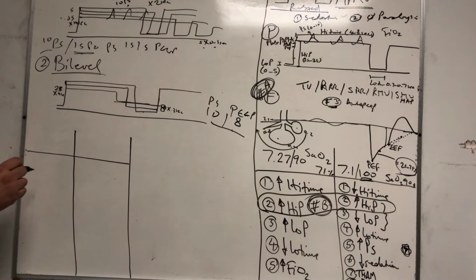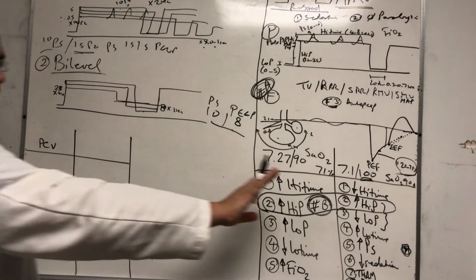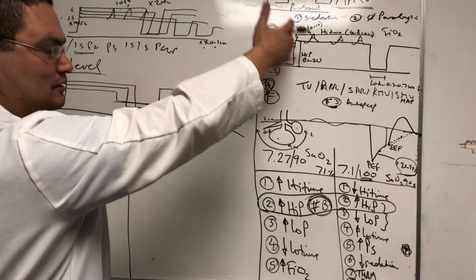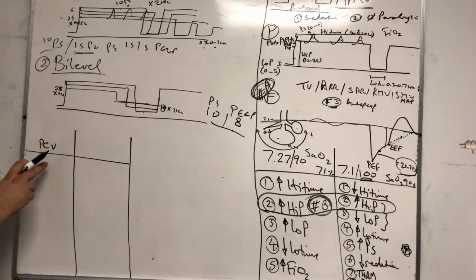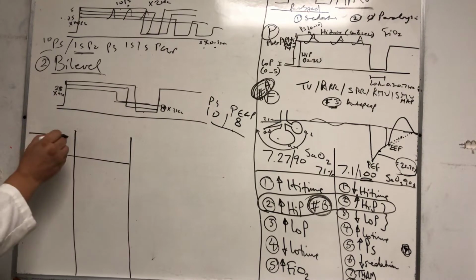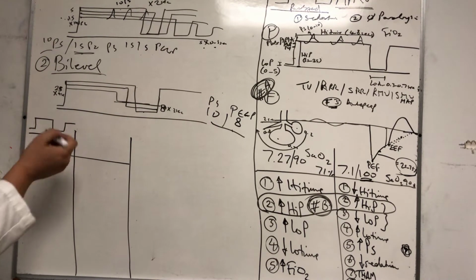So imagine the possibilities now, right? We have now a patient on pressure controlled ventilation. We talked about the possibilities here. This is not a possibility, it's almost a necessity to switch from here to here. But imagine in an ICU that you're using pressure control, volume control. Let's say pressure control. Imagine that I have a patient with inverse ratio pressure control. He's not that sick.